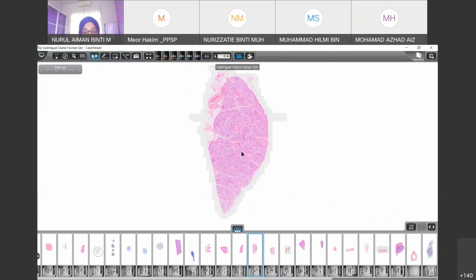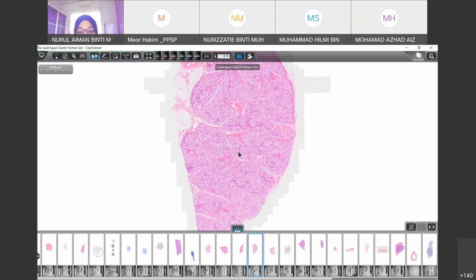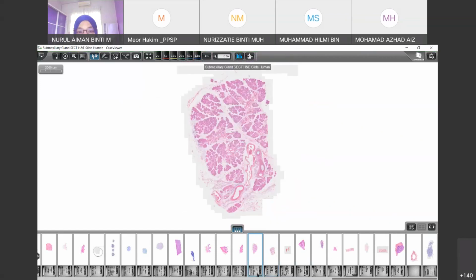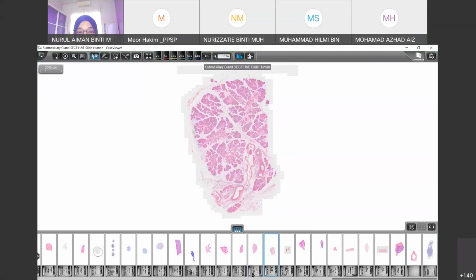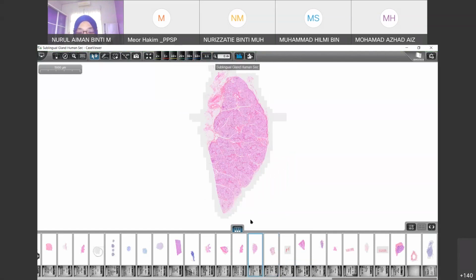So this is already in the topic of the gland. Later I will show you if I can find this stratified columnar. We go towards the sublingual gland first. As you compare, submaxillary is more intense than sublingual. So which one do you guess has the mucus type of gland? More mucus? Sublingual. More serous? Equal? Okay, can I close this?